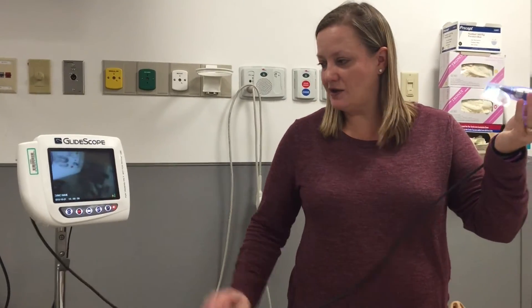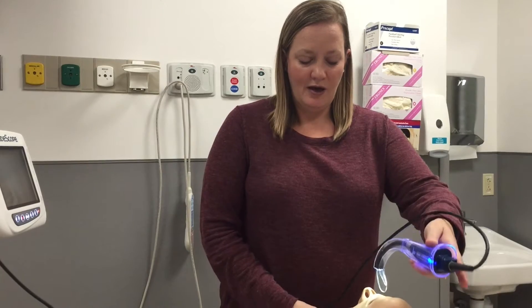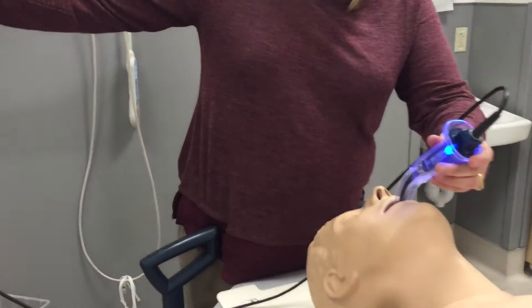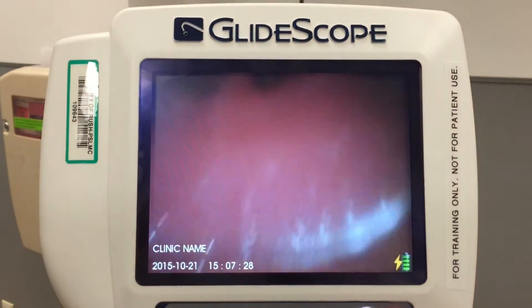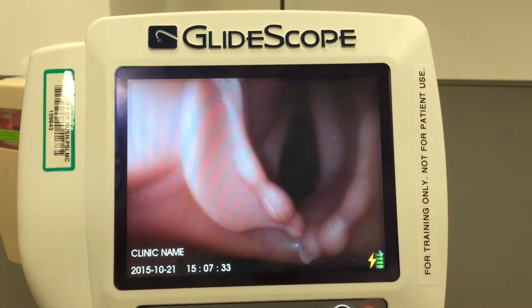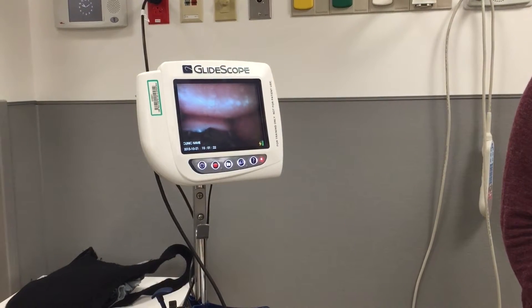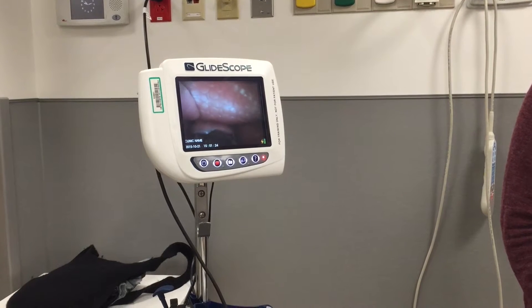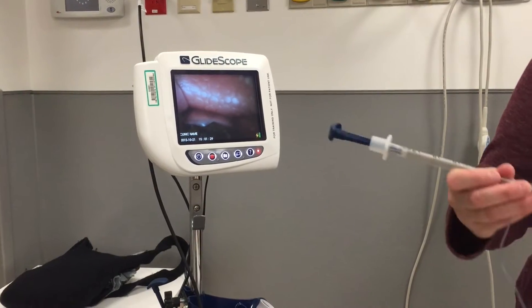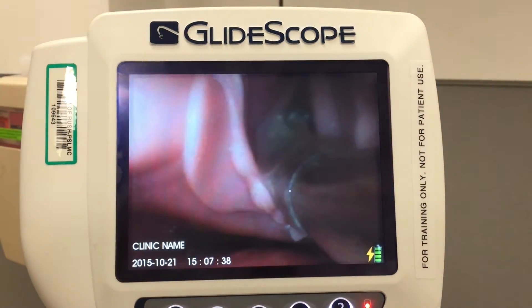You will hold the GlideScope in your left hand and place it in the patient's mouth, watching the screen until you see what you need to see. As you can see, this is the airway that we're looking for. When you see that, you want to pull out just a little bit and crank back, then take your ET tube and direct it into the patient's airway.